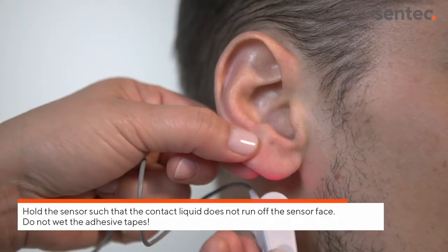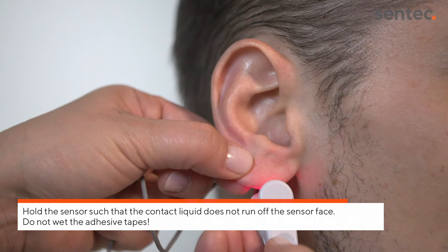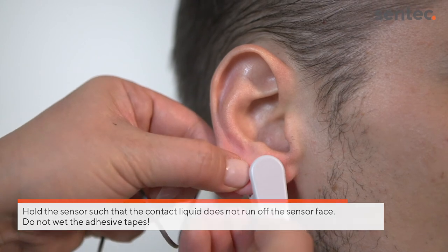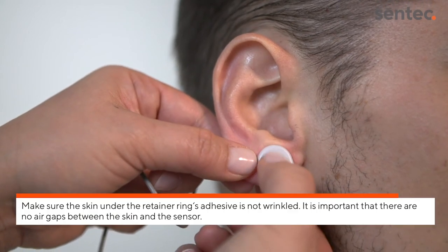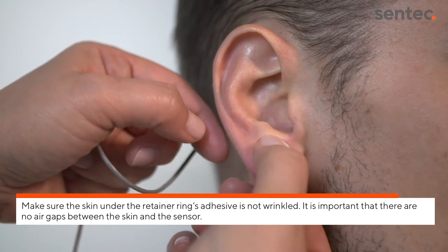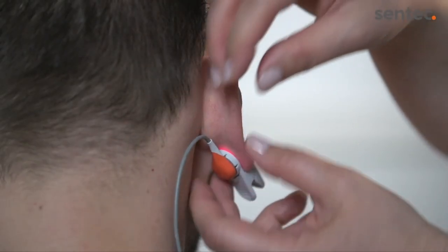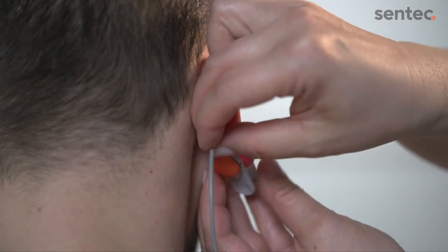Gently pull the earlobe and apply the sensor clip assembly with the sensor on the back side of the earlobe. The sensor's entire dark surface must be covered by the earlobe to ensure correct measurements. Verify that the skin under the retainer ring's adhesive is not wrinkled. It is important that there are no air gaps between the skin and the sensor.